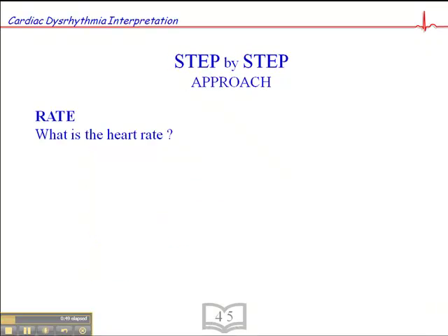So we'll start with heart rate. This is important because if we're dealing with someone who's hemodynamically unstable, we can get a rough idea right in the primary survey — after we've ensured the airway is patent, that they're breathing, and that there's no external hemorrhage — whether the heart rate is contributing to this hemodynamic instability. If they're bradycardic or tachycardic, we look at that as a possible cause. If the heart rate is normal, we have to look at other causes such as pump failure or volume depletion.